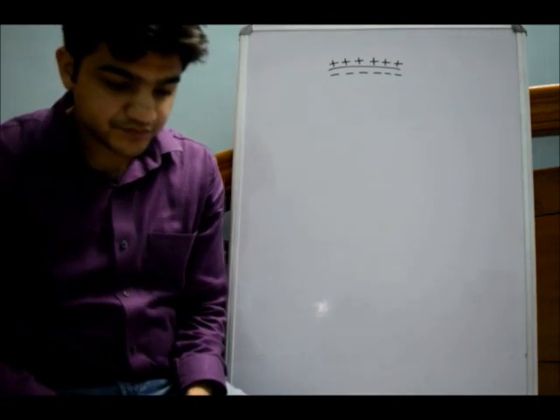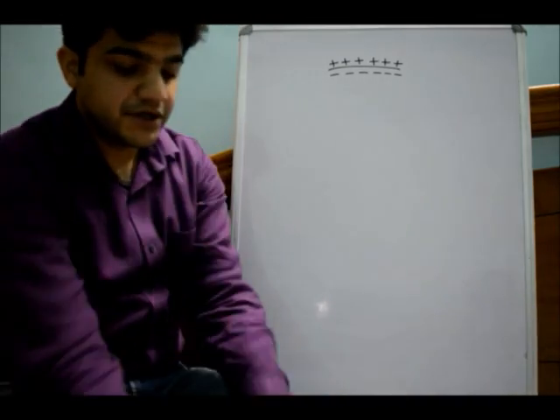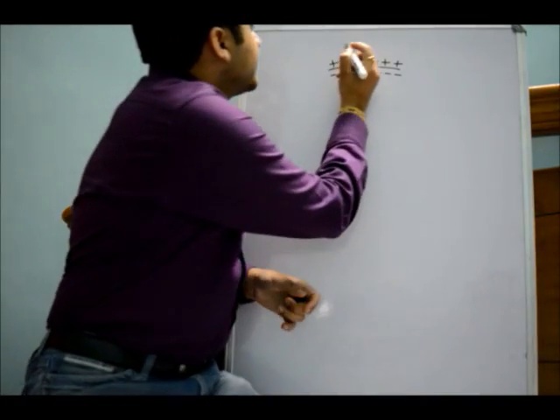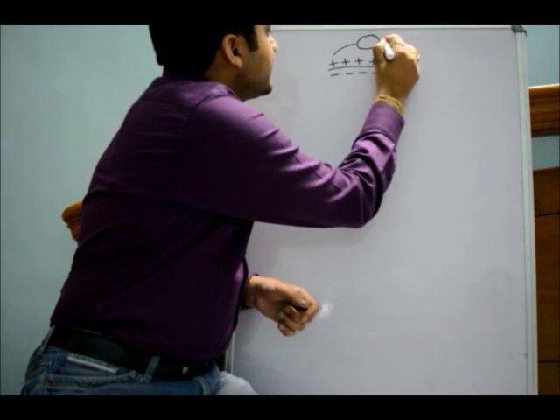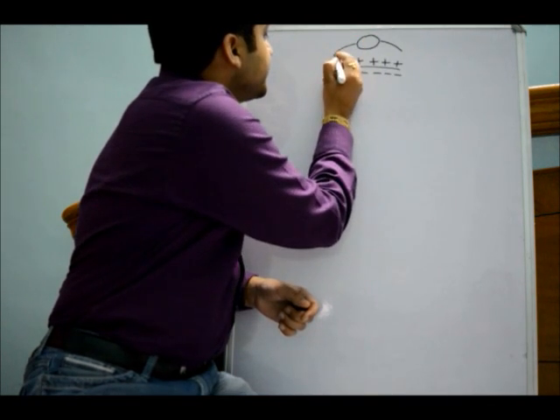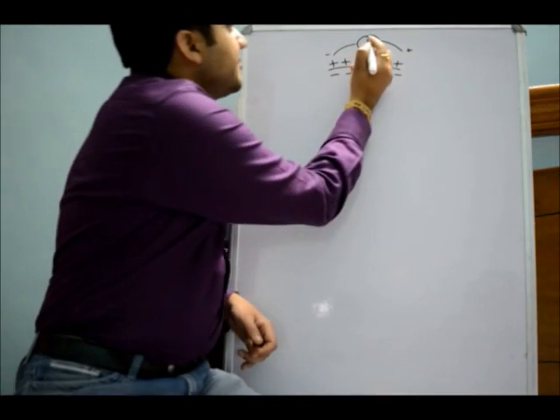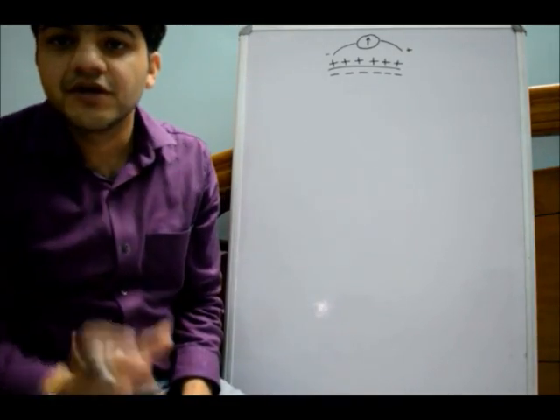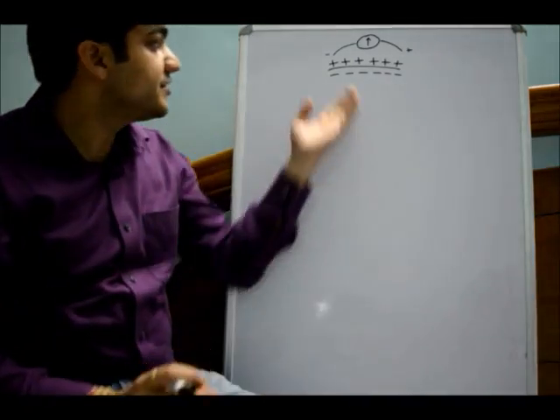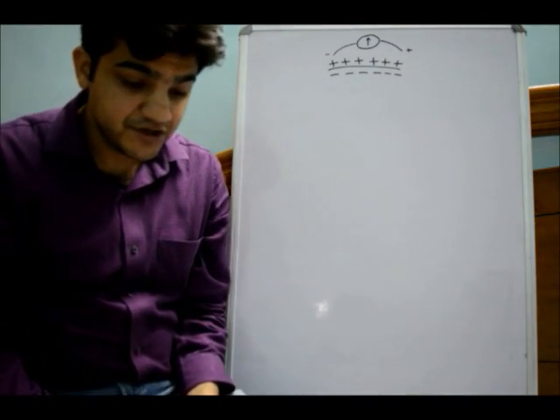Okay, so if you connect two regions by means of a voltmeter having a negative and a positive electrode, there will be no voltage or no current flowing through, because these have the same potential. There is no change in the potential difference.